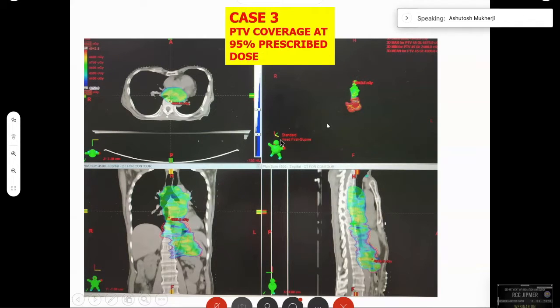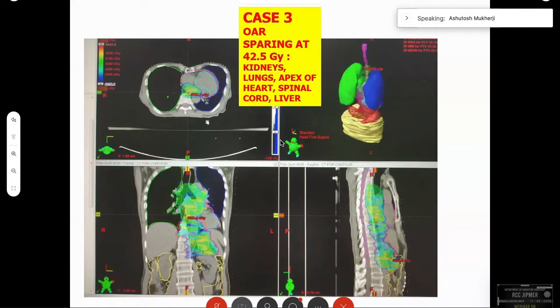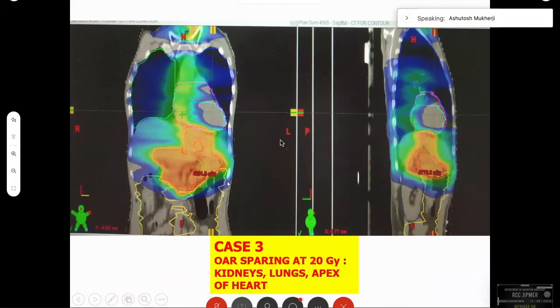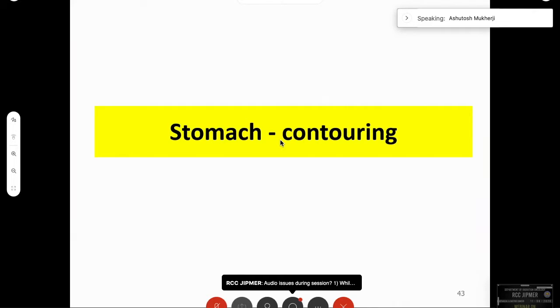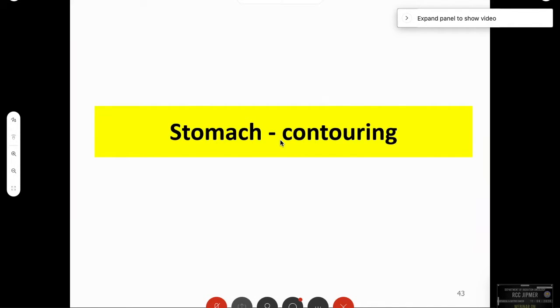In an extended field PTV, coverage seen at 95% of prescribed dose at 42.5 Gy — for OAR sparing at the apex of heart, I am trying to push the high dose areas towards the great vessels and protect the ventricle and apex of the heart from getting high doses. By contouring the apex of the heart as a separate organ, I am able to prevent dose fingers from entering that area. That covers the esophagus section.